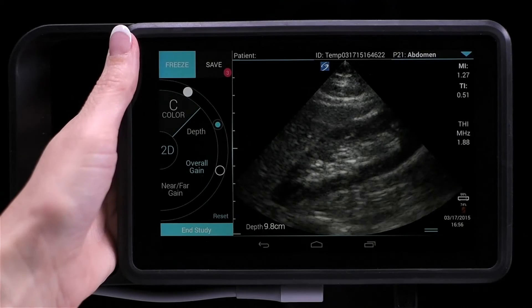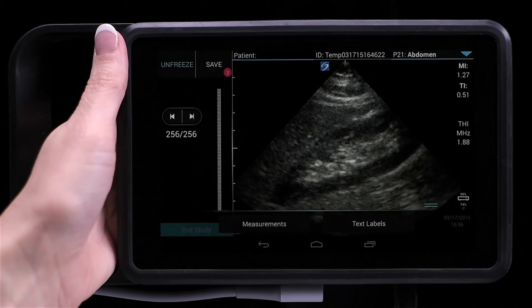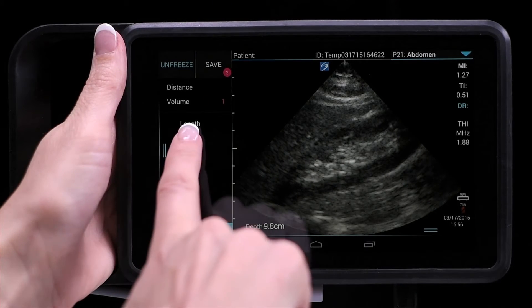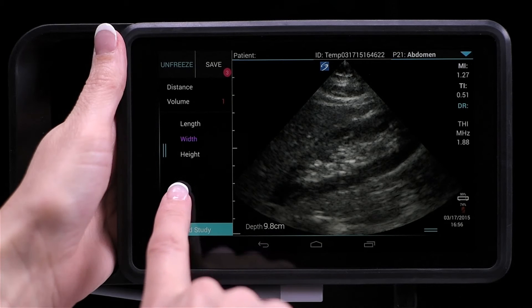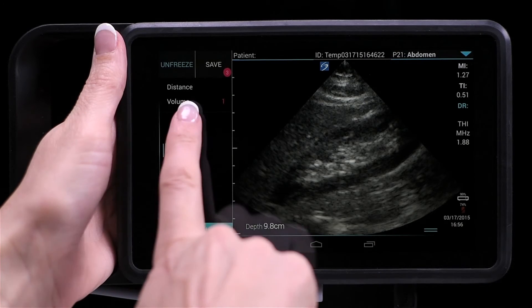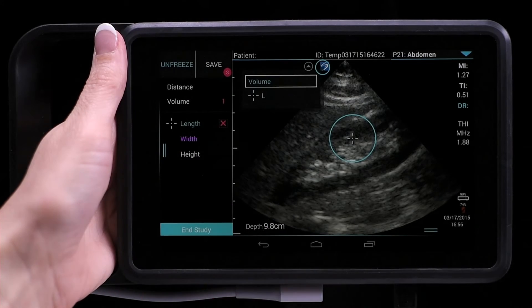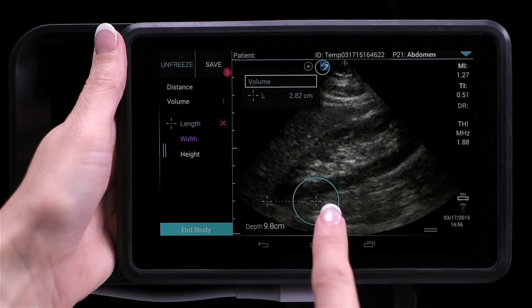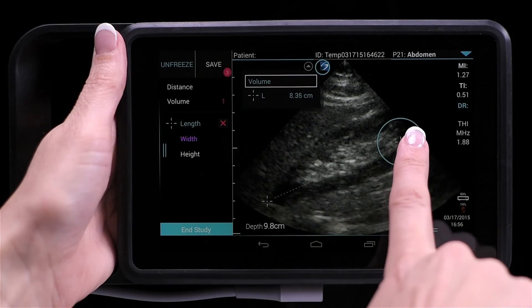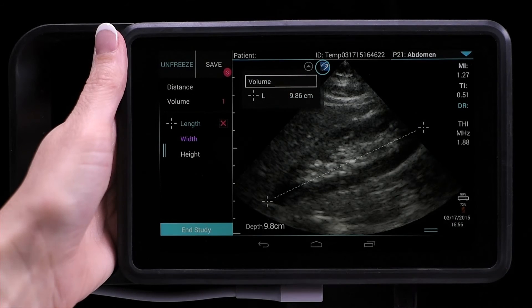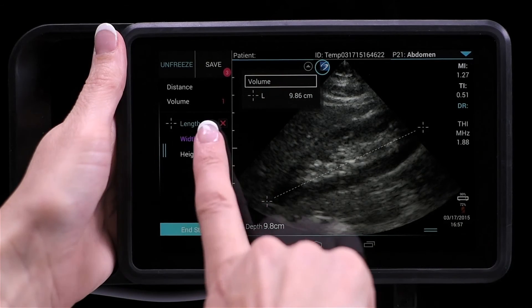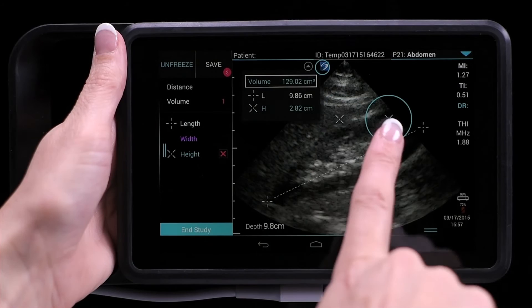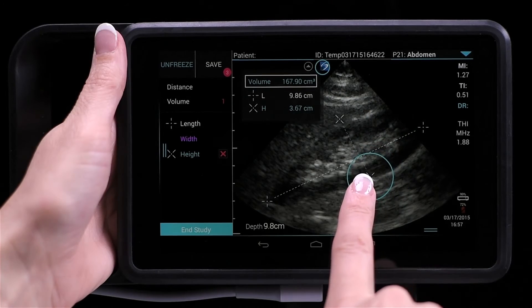A volume measurement requires that you take three measurements: the length, the width, and the height. Simply tap the corresponding measurement and place your calipers on the screen. Once all three measurements are completed, your volume measurement will appear on the upper left side of the screen.